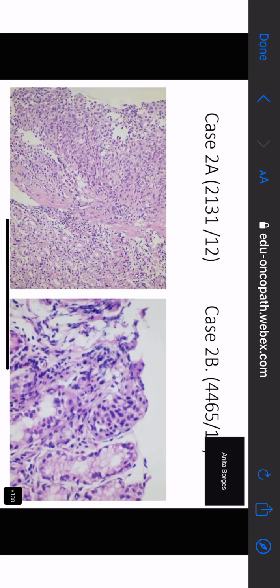Okay. Now, Sweta, what are you seeing here? On the left side, I can see the muscularis propria, sorry, muscularis mucosae, ma'am. And there are few glands beyond the muscularis mucosae. Can you please mark the few glands beyond the muscularis mucosae? They're not glands, ma'am. They're cells beyond the muscularis mucosae. I think there is no glandular arrangement. Sweta, you just have to make a good description, okay? You say where are the glands, and then you say not glands. So make up your mind, Sweta.